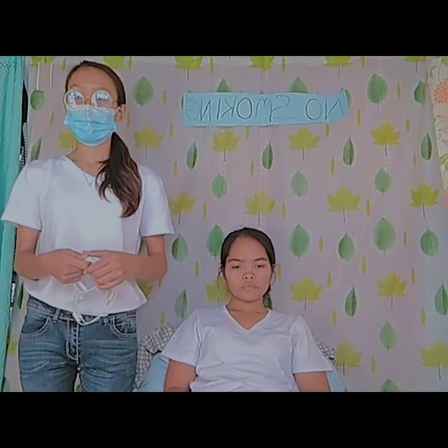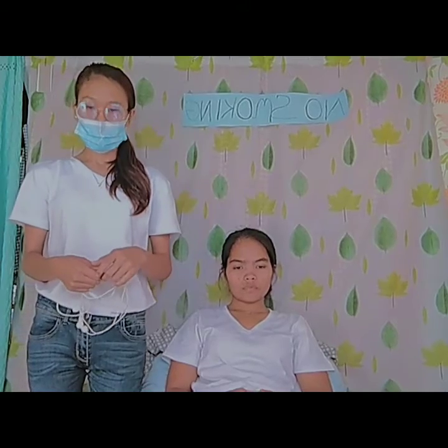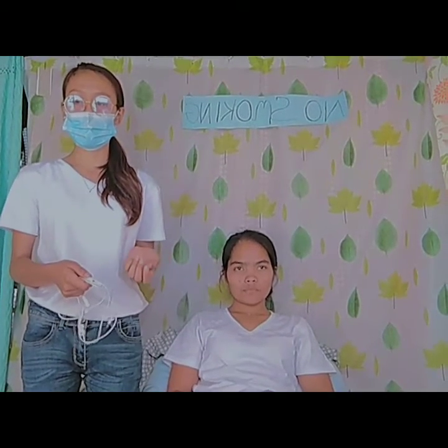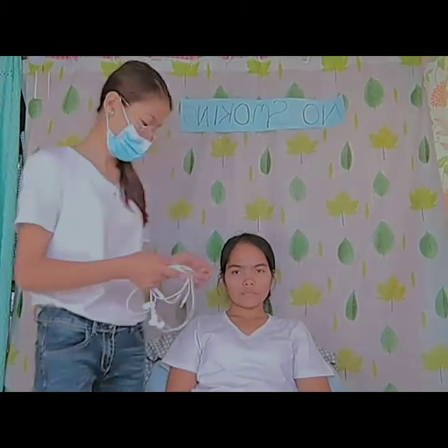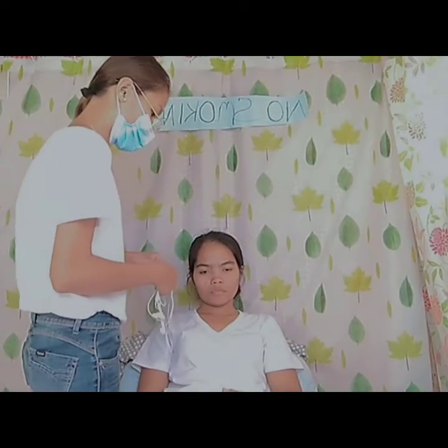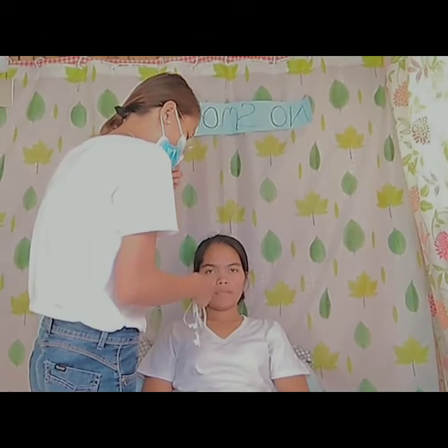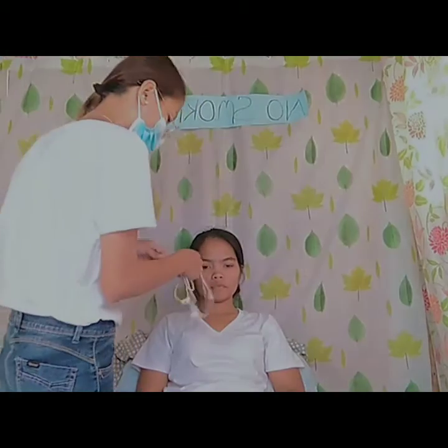For the nasal cannula, first we are going to hold the nasal cannula in proper position, with the prongs facing or curving downward. Then after that, we are going to place the cannula prongs into the nares of the patient, okay? Then we are going to wrap the tubing behind the patient's ears.